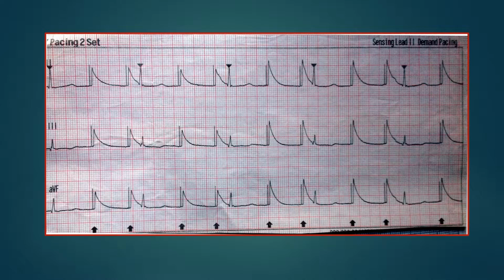Why does this happen? Well, it happens because when you pace the chest wall in transcutaneous pacing, there would be a huge artifact from all that skeletal muscle being paced, and that artifact would take your line or your picture right off the page, and it would be a real mess. So the monitor is programmed to close its eyes for a moment, for just 40 milliseconds, which is one small block, and it closes its eyes and doesn't look at the ECG.